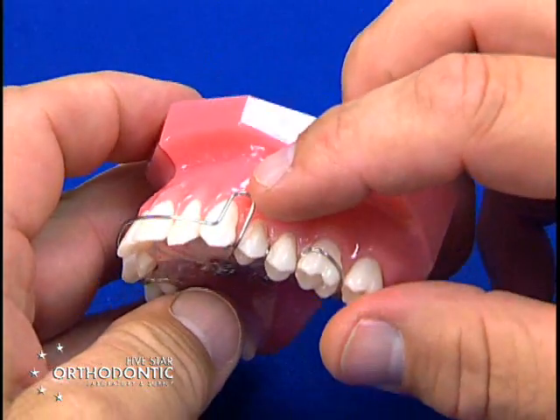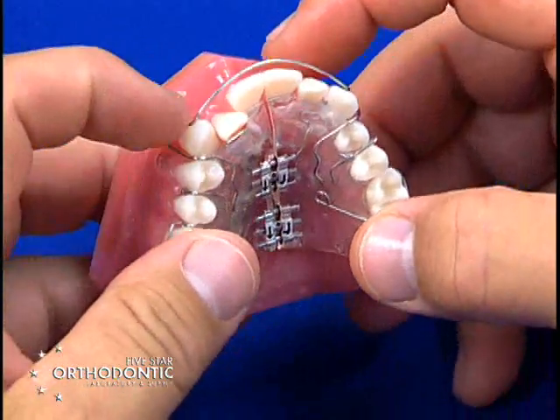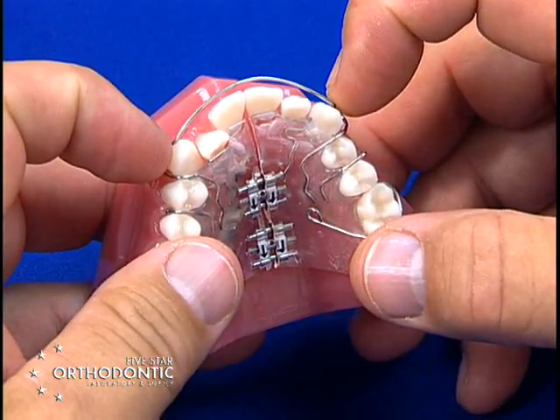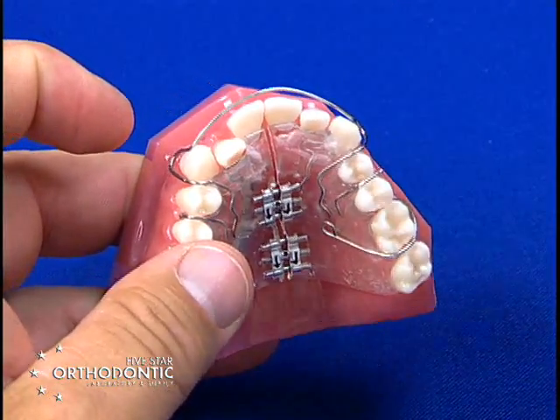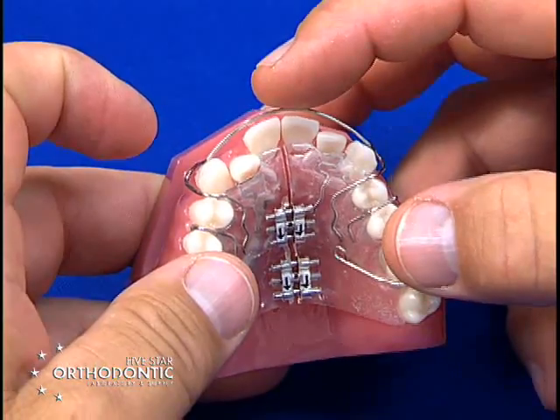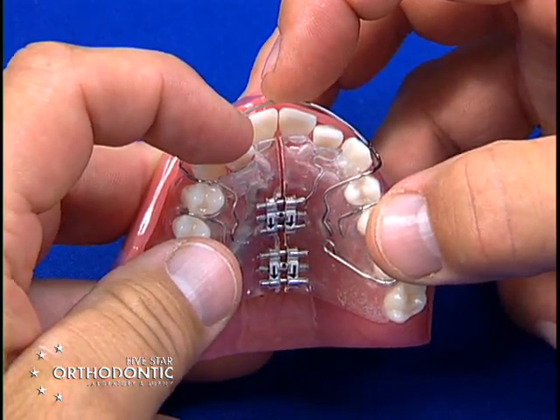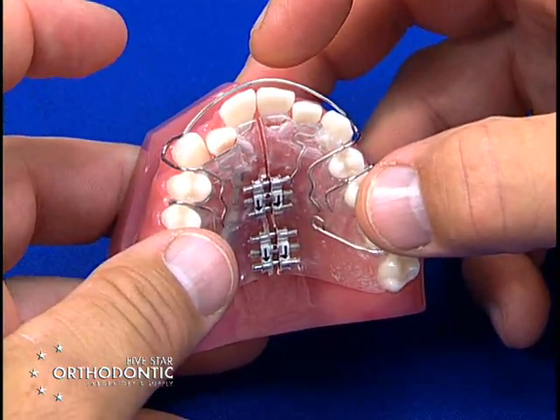When you activate the bow and take it out of contact with the flat-on-flat, the bow should be about one millimeter away from the incisors, unless you're trying to derotate a tooth. What you want to do is keep the bow in contact with the part of the tooth that is most labial, not the part that is lingual — that will help derotate as you expand.